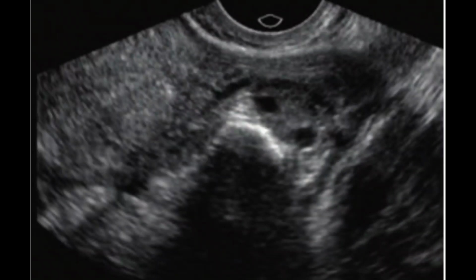This is a transvaginal image. On this image, you can appreciate a small hypoechoic tubular structure, which is the fallopian tube. This fallopian tube is not significantly enlarged, although it is enlarged to some extent, because if it is visible, it means it's enlarged. We will call it a mildly enlarged fallopian tube. In the view, you can appreciate the ovary as well.